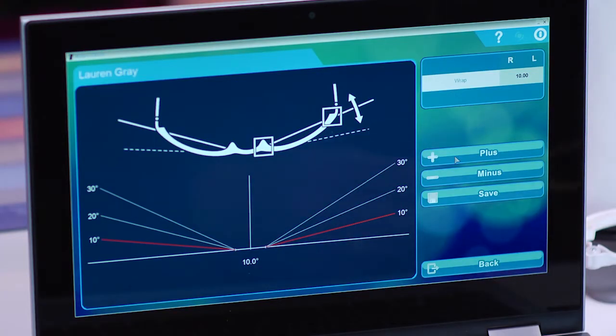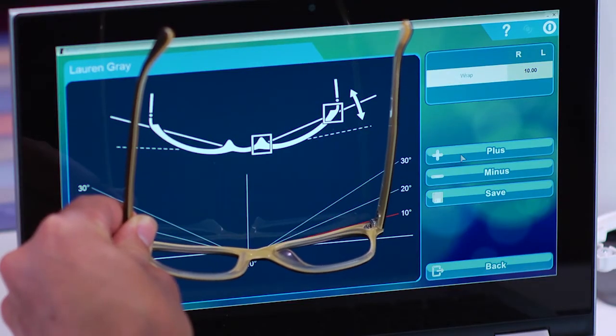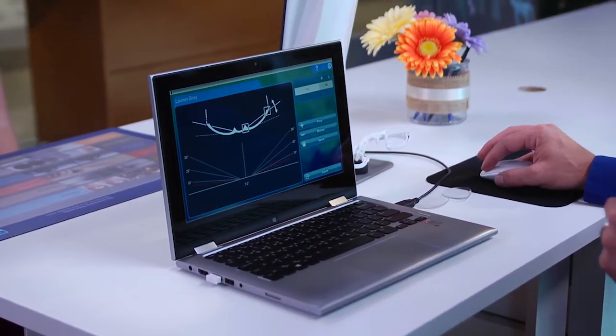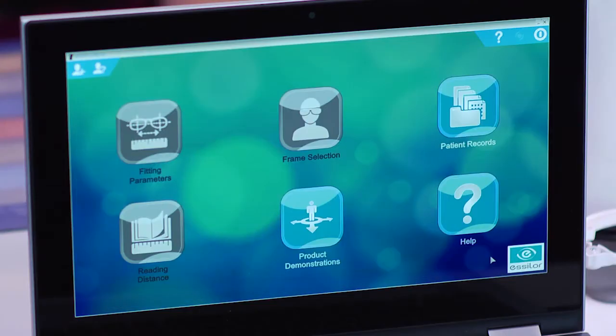To adjust the curve, click on the red adjust the curve icon. Keep the patient's frame in the center and verify that the top is aligned with the horizontal line on the graphic. Click on the plus or minus icons until the red line intersects with the rim at each end. Click on the save icon to save the curve and return to the previous page. Then click on the save icon again to save all your measurements and return to the home page. If any of the results are displayed in red, check the value and confirm if you think the measurement is reasonable. If not, check the boxing and take the pictures again if necessary.